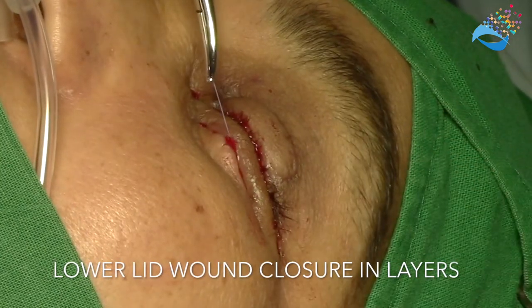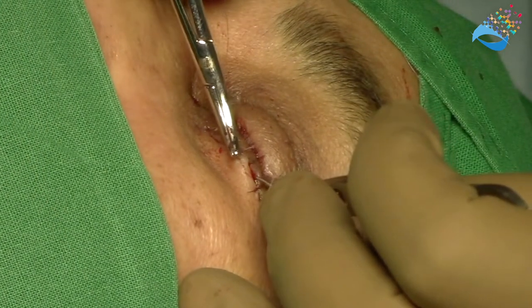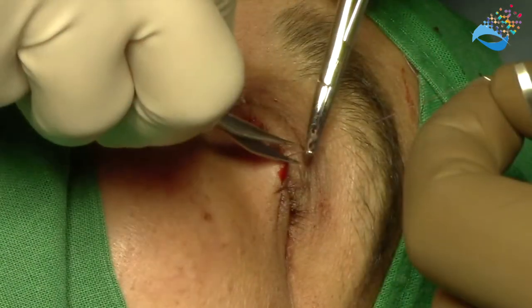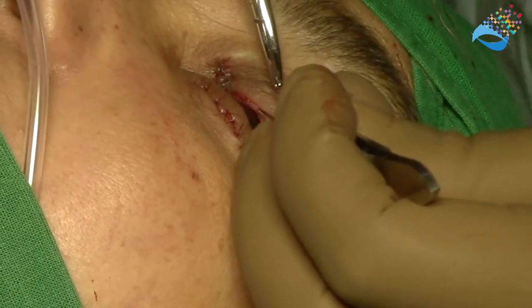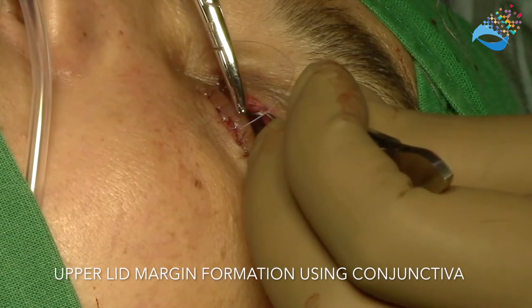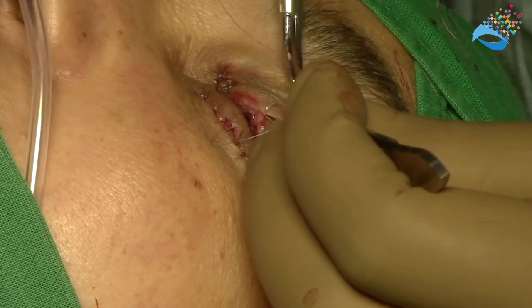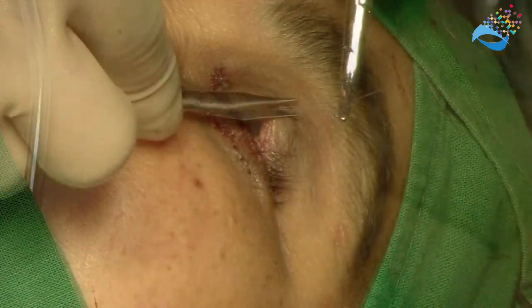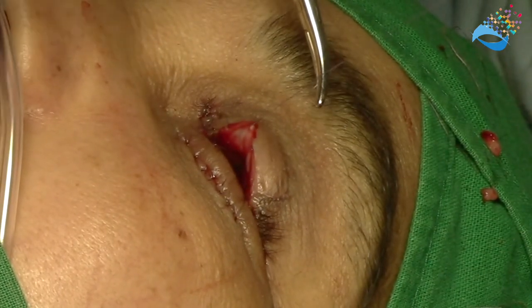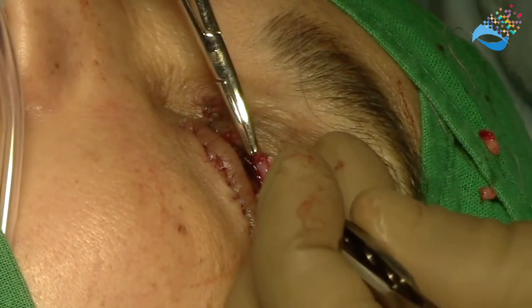The orbicularis and the skin are closed in layers. The conjunctiva typically heals with granulation. The final step is using the upper lid conjunctiva to create the lid margin. The conjunctiva is rolled back and sutured to cover the cut end of the skin and the orbicularis, thus creating a mucocutaneous junction for the upper eyelid margin.